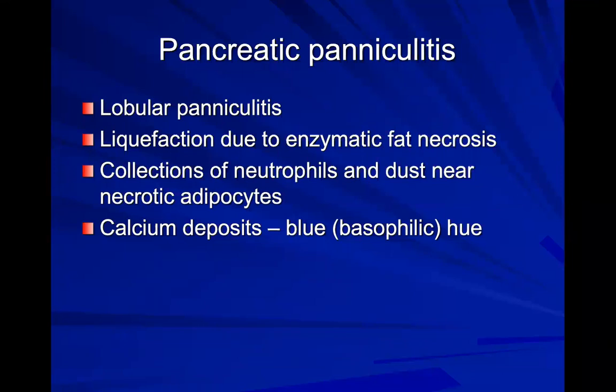All right, so pancreatic panniculitis, alpha-1 antitrypsin-induced panniculitis, these things can cause a panniculitis that's prominent with neutrophils. It's lobular. What you're going to see with pancreatic panniculitis is this liquefaction due to the enzymatic fat necrosis.